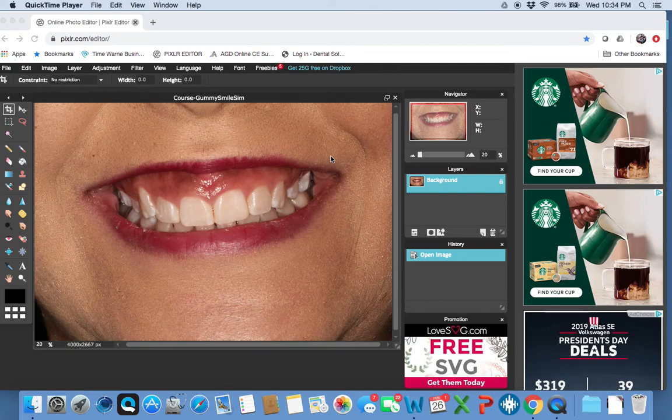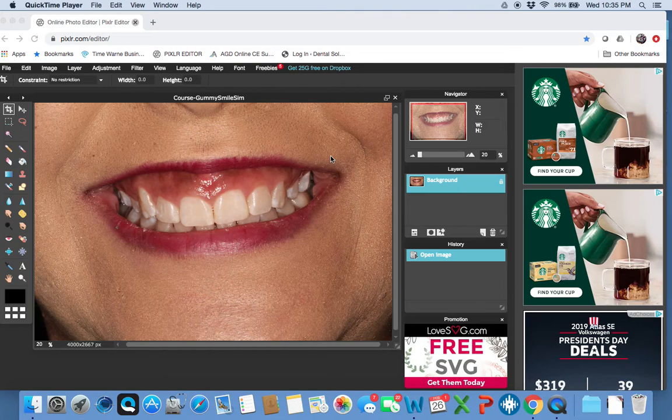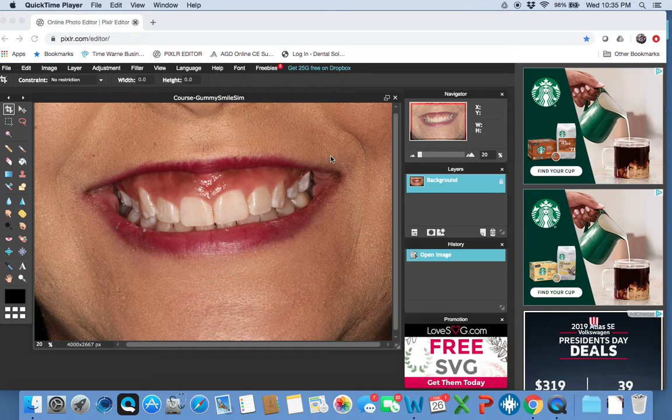My name is Dr. Michael Capio, and I am a dentist in Marina del Rey, California. What I wanted to show everybody today is how to virtually correct a gummy smile using a Photoshop-like program called Pixlr.